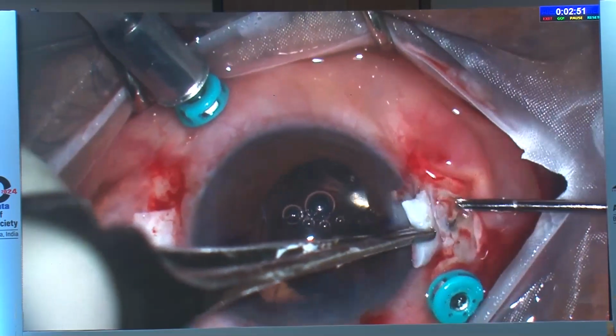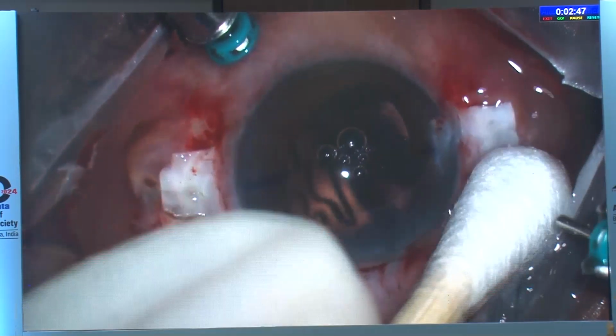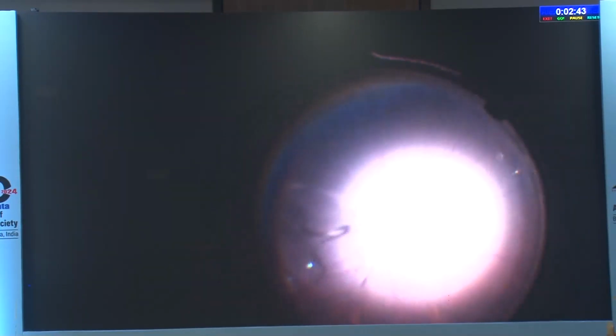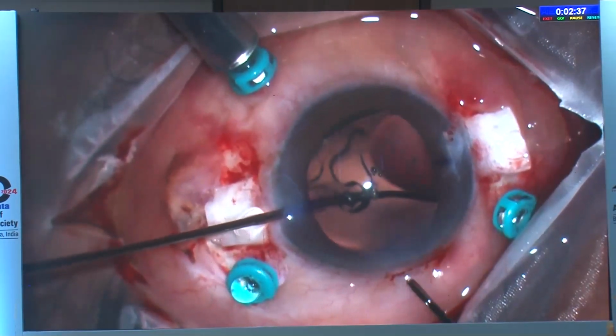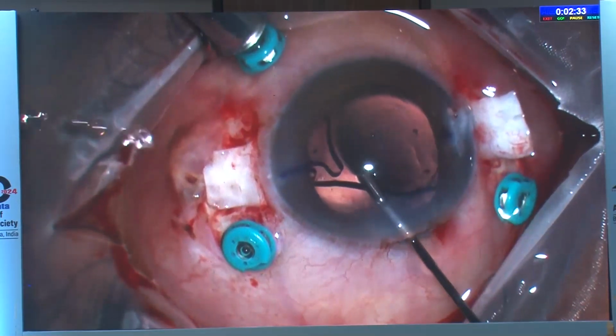But yeah, the other side is also tucked well, but as soon as I was removing the trocar, I saw the other end going down. So probably I had pulled the other end a little more, with a little extra force. So now you can see the T is broken. So I have to bring it out.